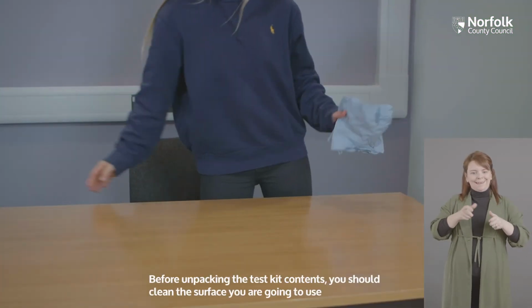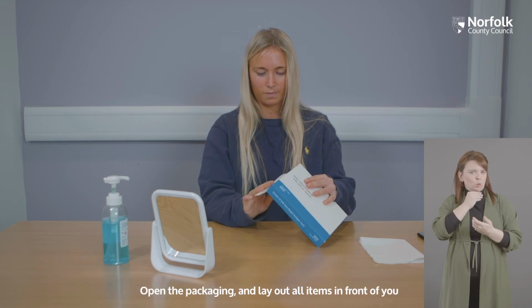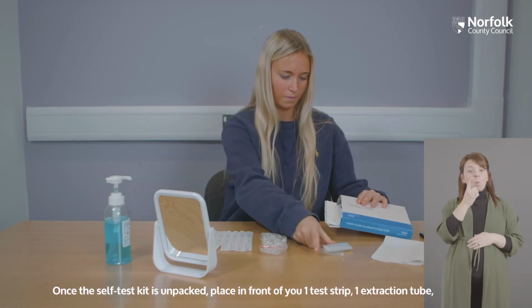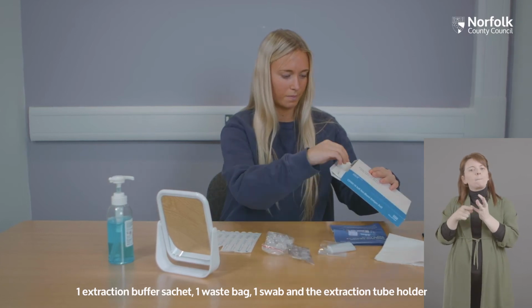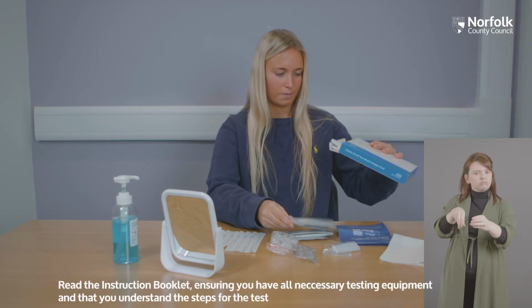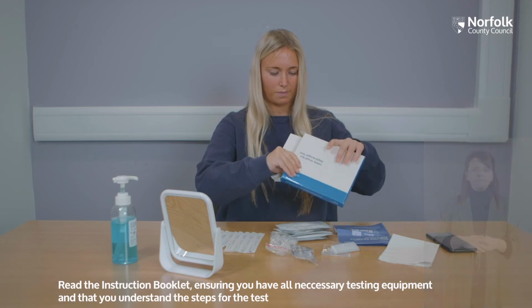Before unpacking the test kit contents, you should clean the surface you are going to use. Open the packaging and lay out all items in front of you. Once the self-test kit is unpacked, place in front of you 1 test strip, 1 extraction tube, 1 extraction buffer sachet, 1 waste bag, 1 swab, and the extraction tube holder. Read the instruction booklet, ensuring you have all necessary testing equipment and that you understand the steps for the test.